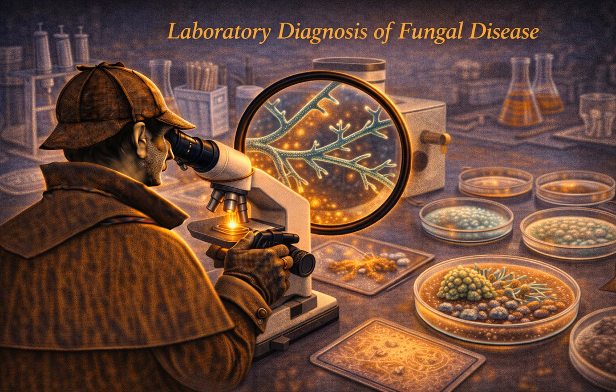But if everything grows, doesn't that include all the normal bacteria? Yes. And that is a huge problem. If you have a sterile specimen like spinal fluid or deep tissue, non-selective media is great. But if you have a sputum sample from the lungs or a skin scraping, those are naturally full of normal bacterial flora. Bacteria replicate every 20 minutes. Fungi might take 20 hours to double. If you put them on the exact same plate, the bacteria will swarm the entire plate and eat all the nutrients before the fungus even wakes up. So you need to clear the field.